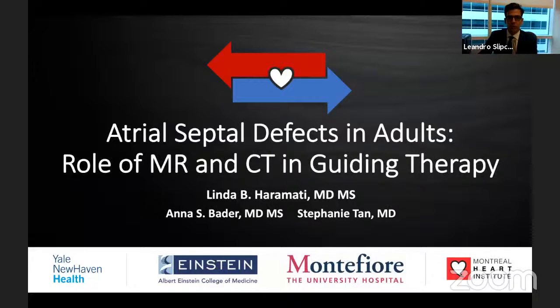It's a pleasure today to have Linda Haramati, who will be talking about atrial septal defects in adults: the role of MRI and CT in guiding therapy.